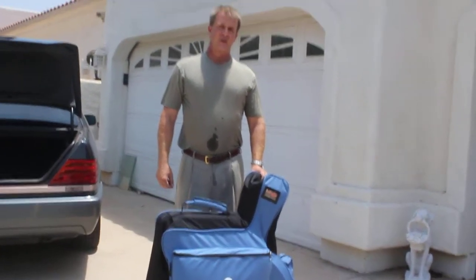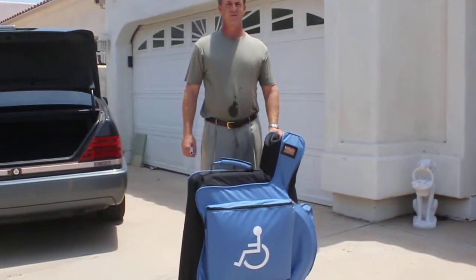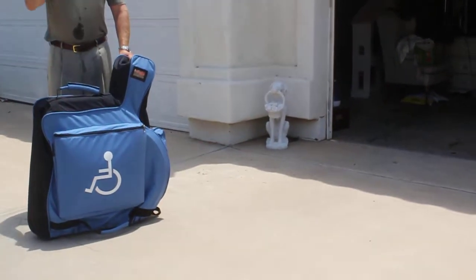Thank you for allowing me to demonstrate our wheelchair carrying case, affectionately known as the WC Caddy. If you or somebody in your family, somebody that you know, has a manual wheelchair in their life, buy them this product.